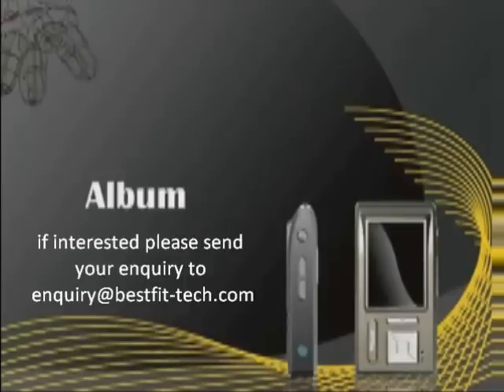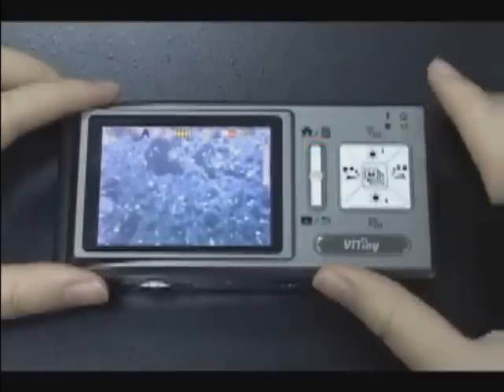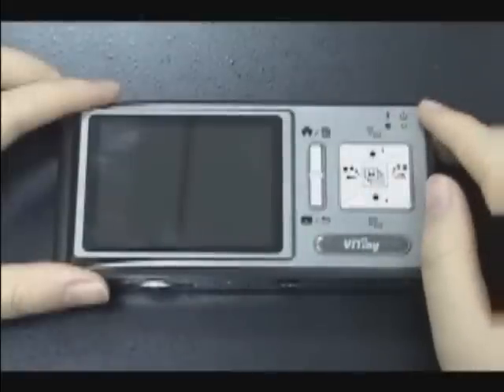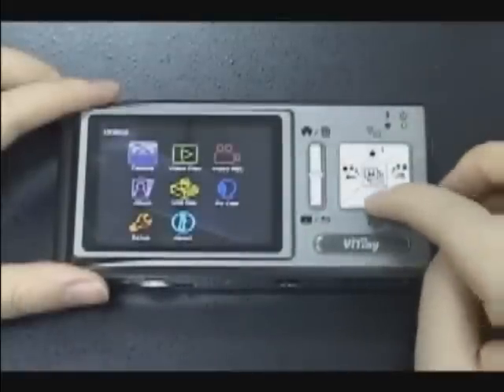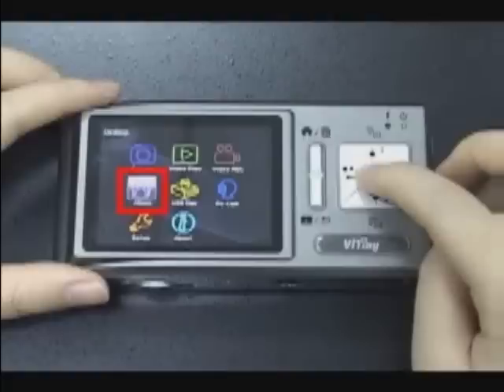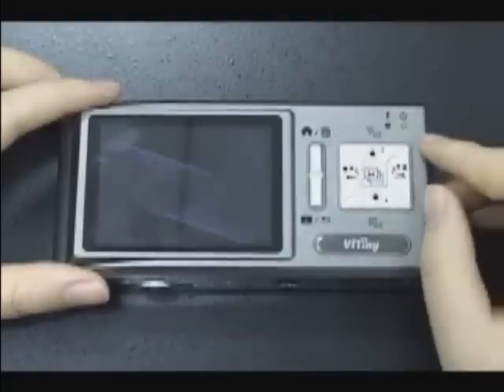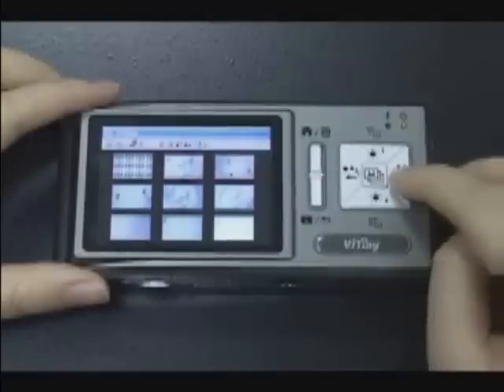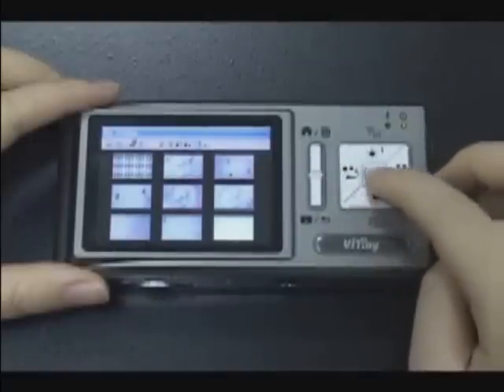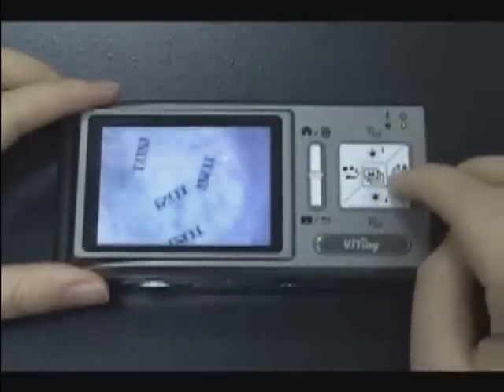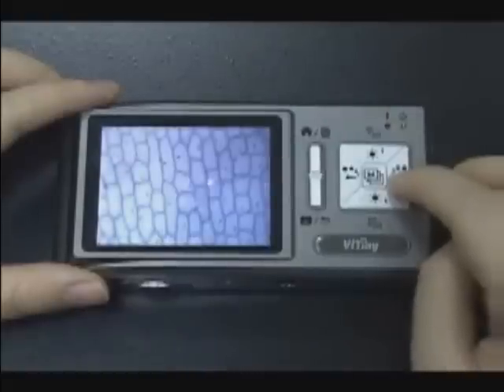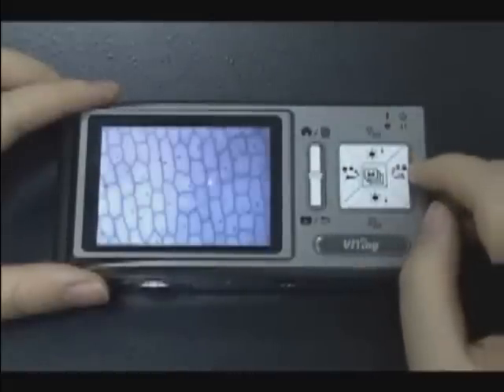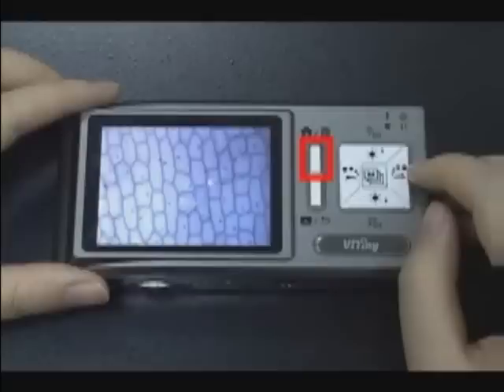Album. Press the menu button to enter menu display. Select the album icon to see all the captured images. Press the middle button to get the full screen display. Press the delete button to delete an image.